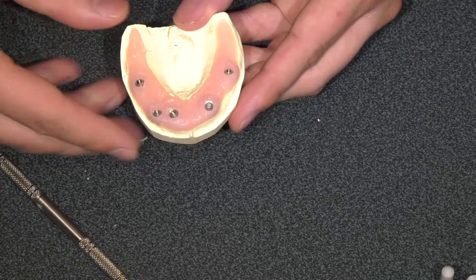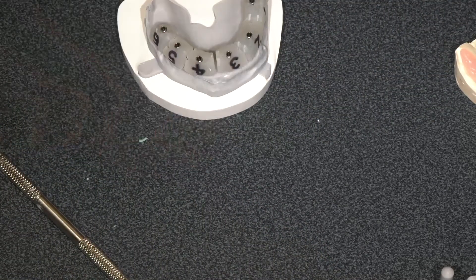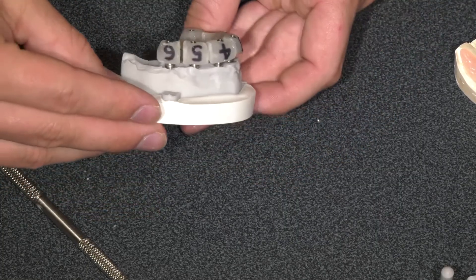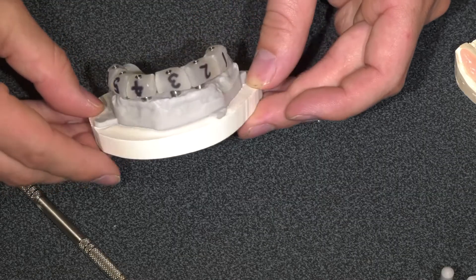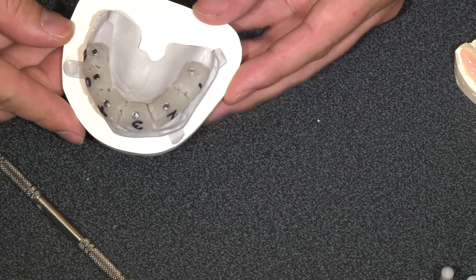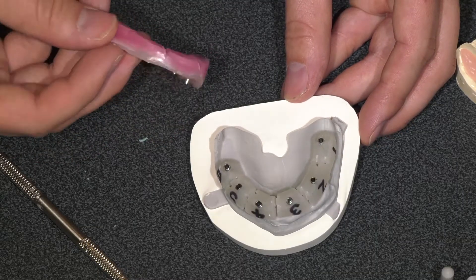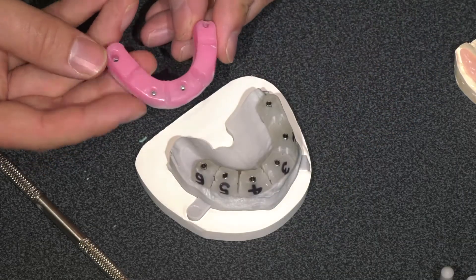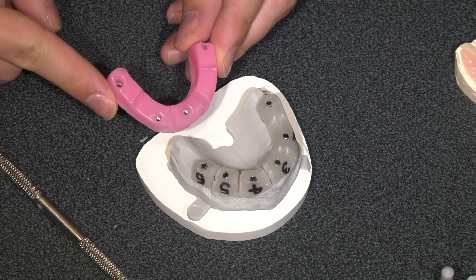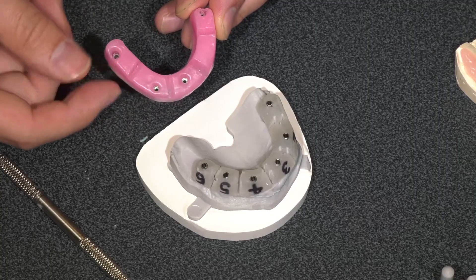The lab — we use ProSmiles Dental Studio up in Rapid City, South Dakota — they're going to send you a V-jig or verification jig. The verification jig is going to separate all the implants; they use some form of triad and each one has its own titanium coping. They're also going to send you a wax rim just to get the record of the bite. The wax rim will typically not have all of the copings luted — this one only has four — and typically I will only engage one screw if that's enough to keep it steady to get my bite record.